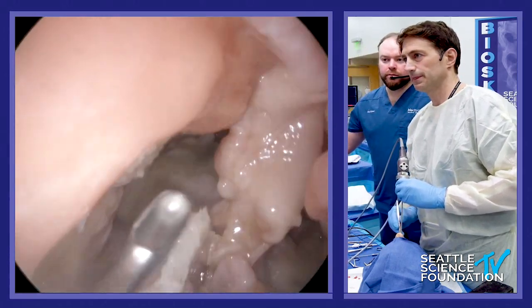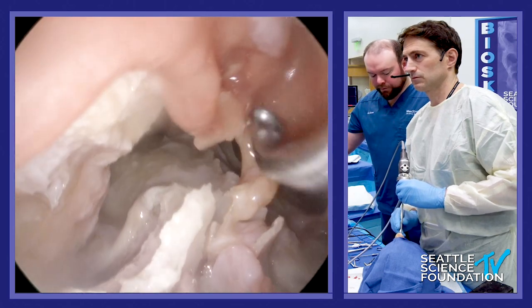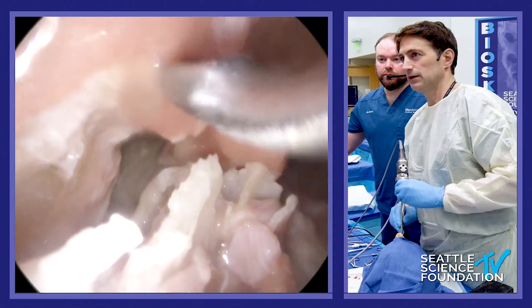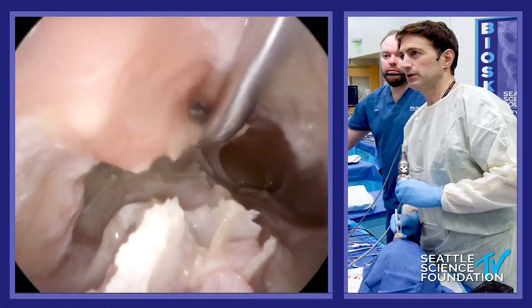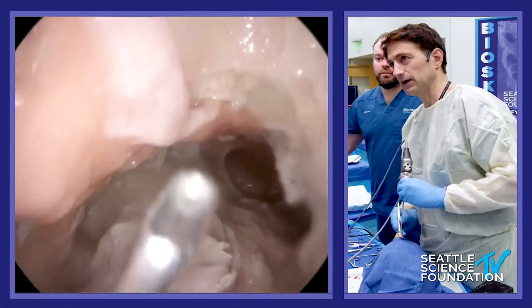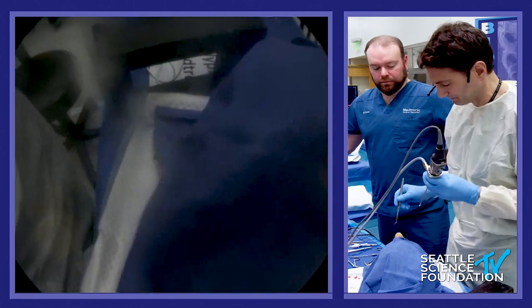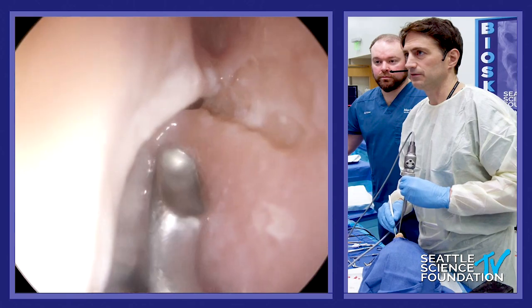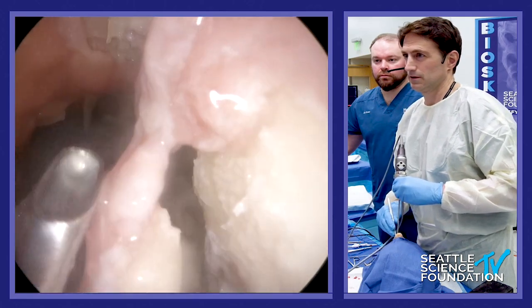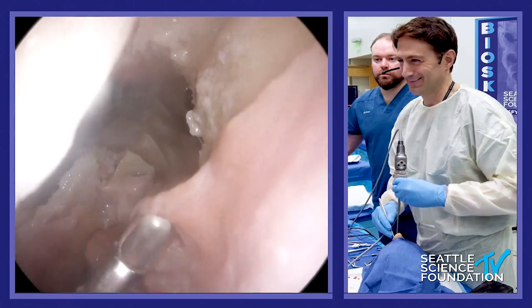We've got one flap over here. Usually we're drilling pretty far up, so it's a good idea to have as much exposure as you can. If it's kind of a short Draf Three, use one of these flaps and swing it across — just go up to the nasal vault on the other side, that's also an option. You want to cover as much as you can. Same thing on the other side. This one got torn a little bit, Arif — sabotage. It thinned out a little bit right here.